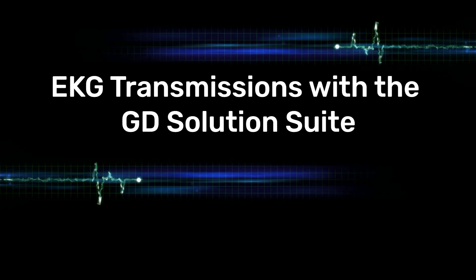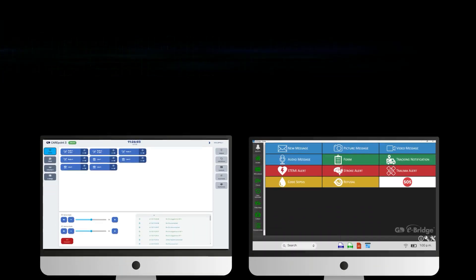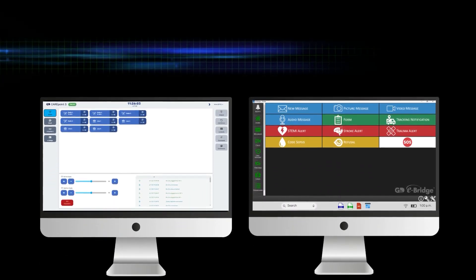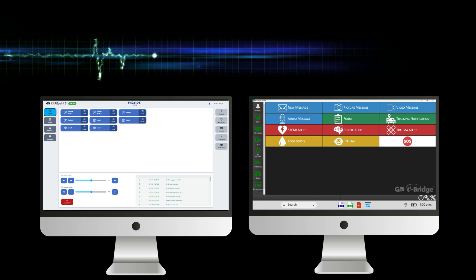12 Lead EKG Transmissions with the GD Solution Suite. Here, we will showcase how the GD Solution Suite handles 12 lead EKGs.